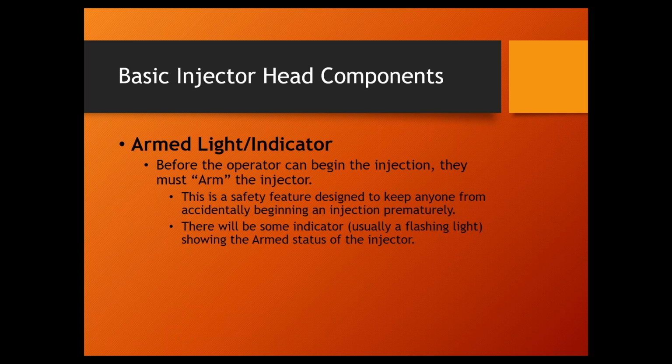They do actually have that capability, but it's never used. It's called the EDA, extravasation detector. Or no, I'm sorry, that's different. That's for the extravasation. They do have air detectors, but they never use them. And here's the reason they never use them. Infusion pumps have air detectors.